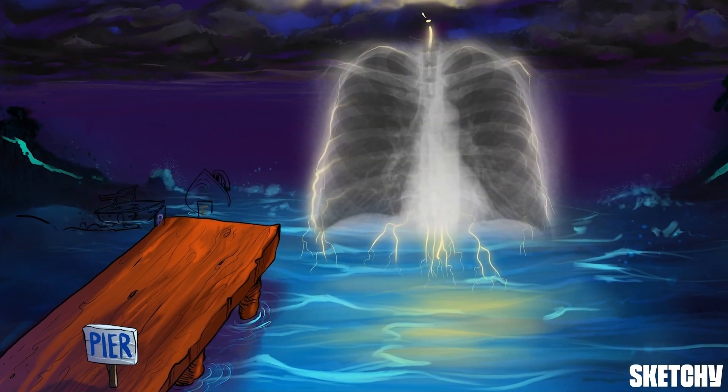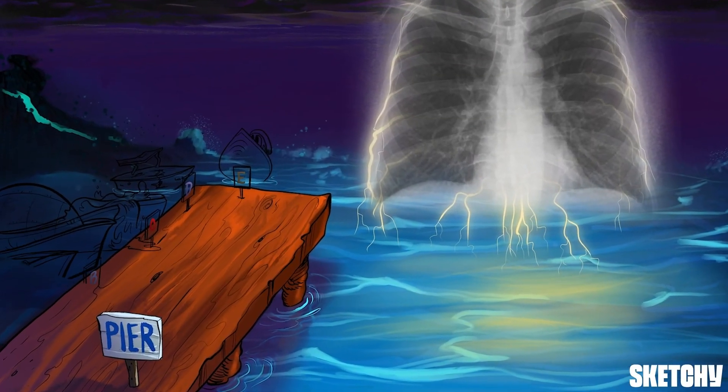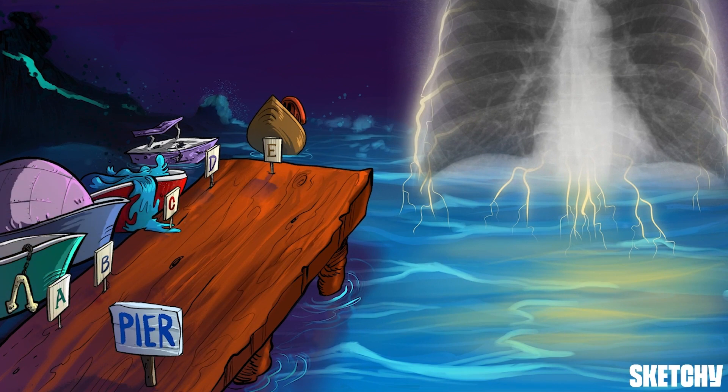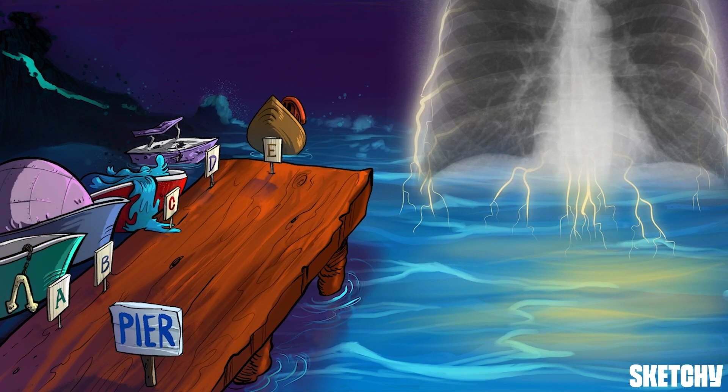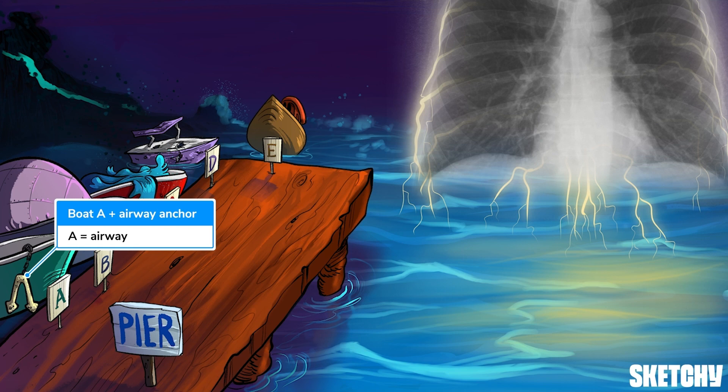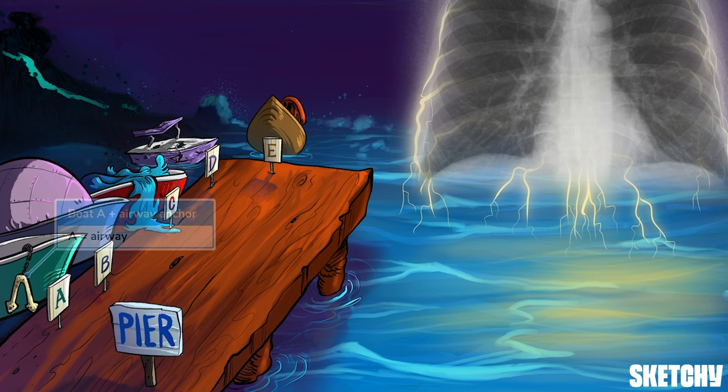All right, quality image in hand, there's a methodical approach for reading a chest x-ray. Think ABCDE. Boat A here, with its airway-shaped anchor, is a reminder to assess the airway.